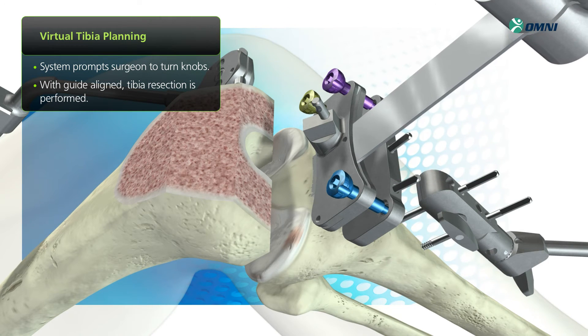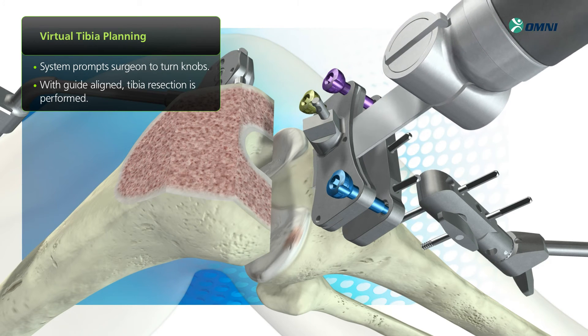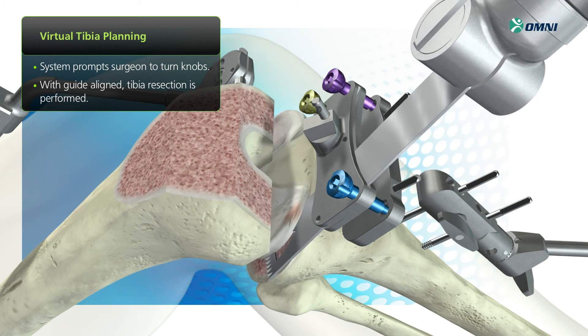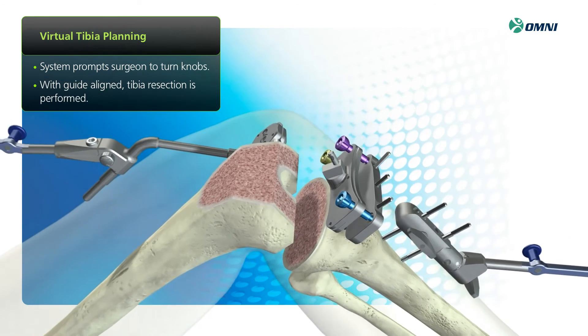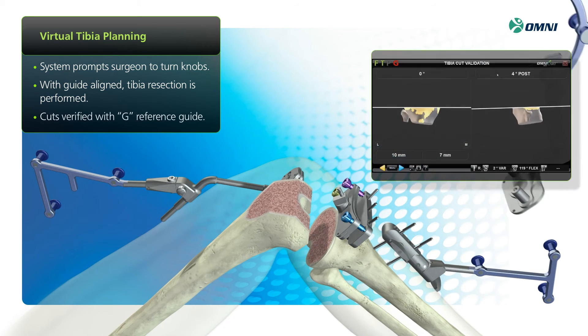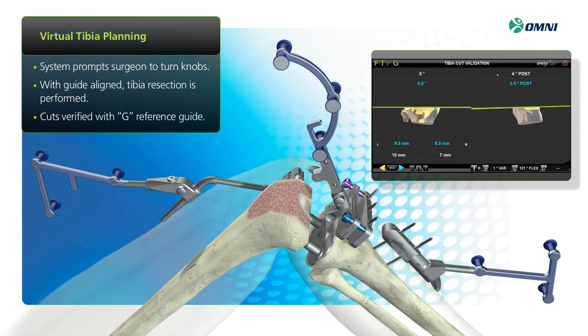Once the guide is positioned, you can perform the tibia resection. Then verify the cut with the G reference guide. A green line on screen indicates the cut was executed per your plan.